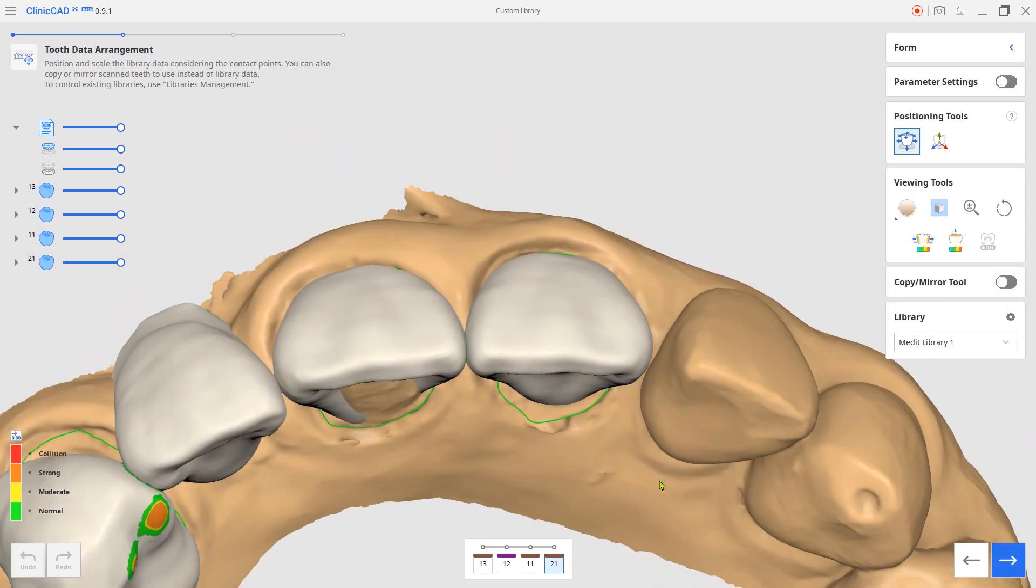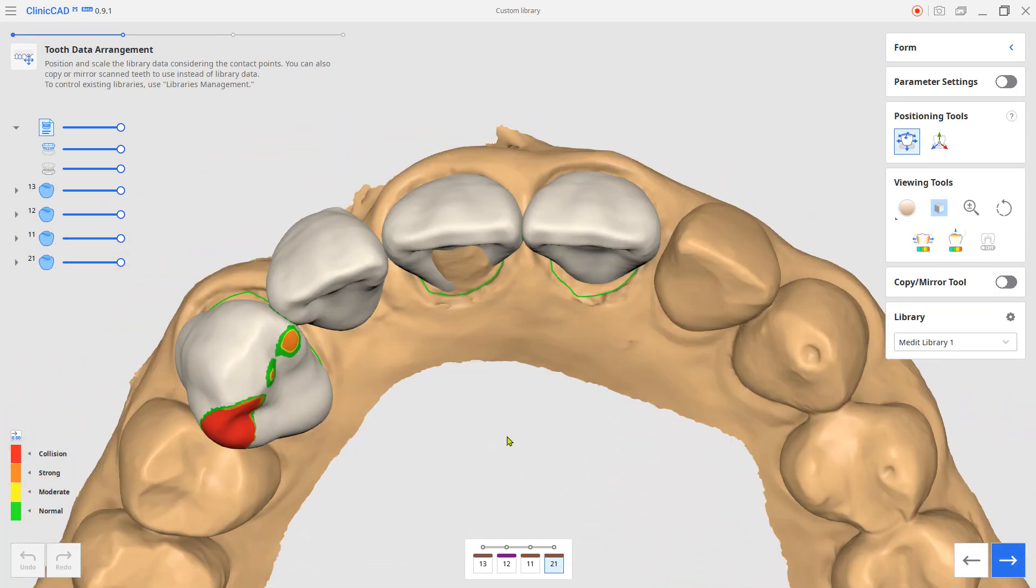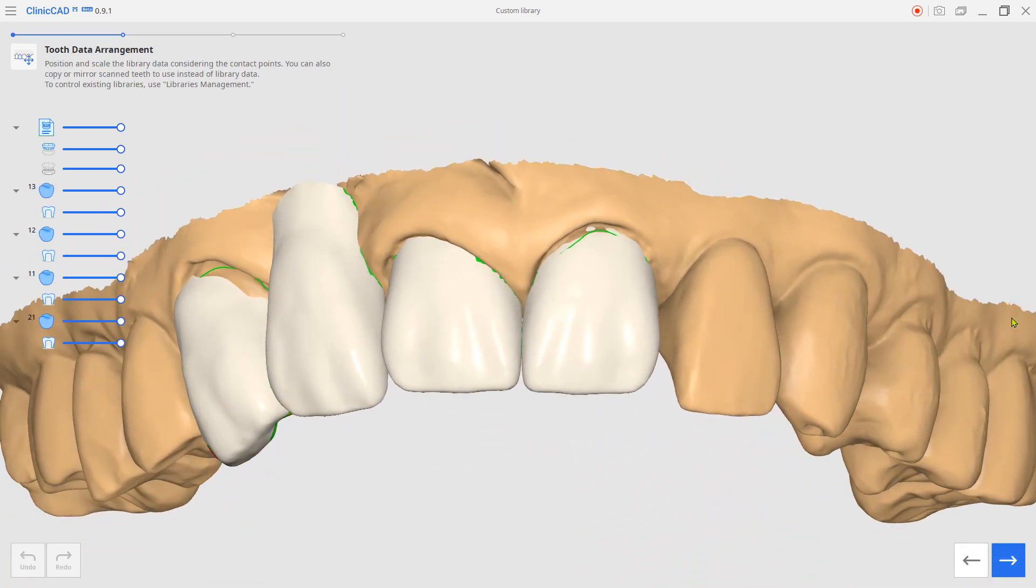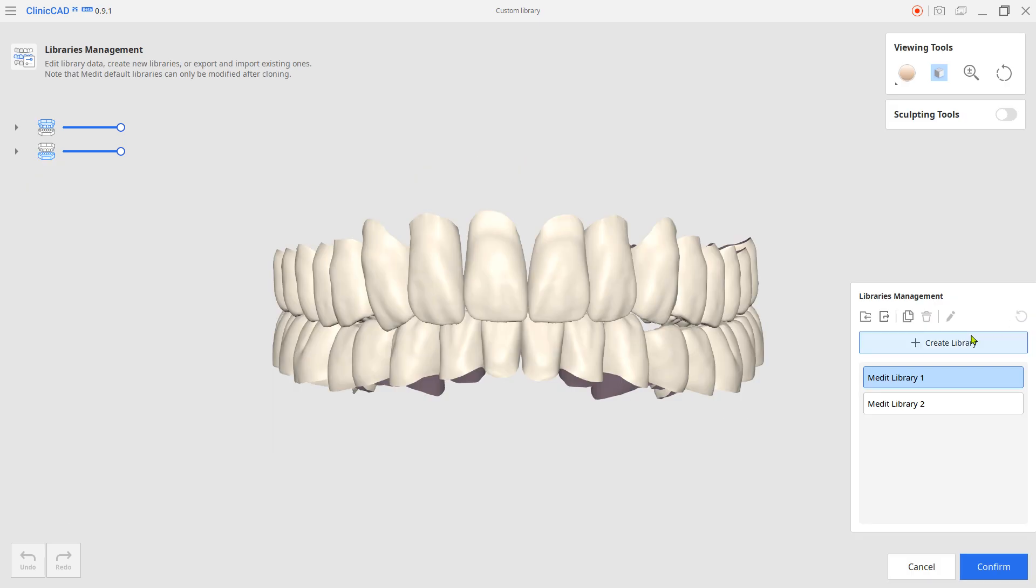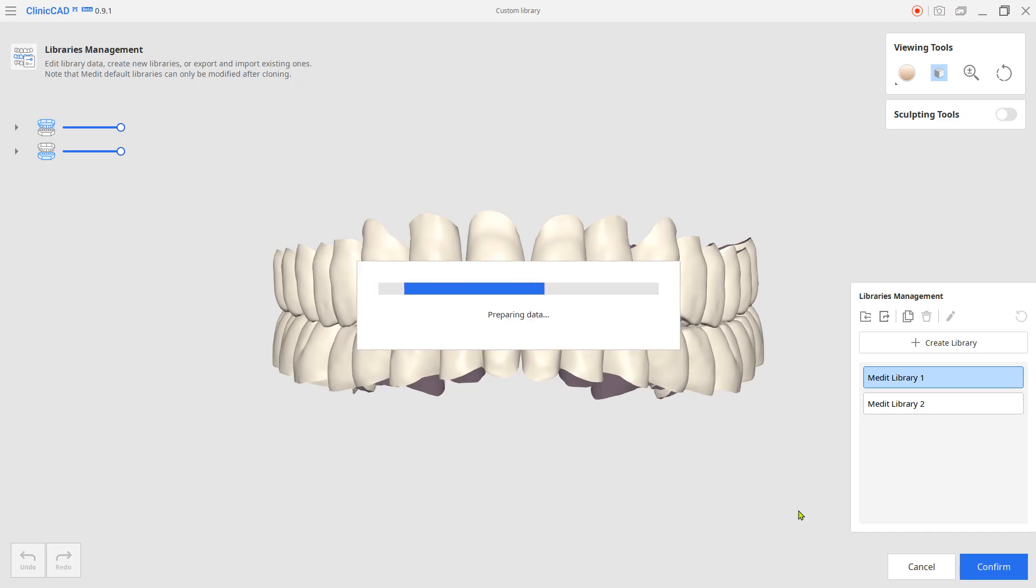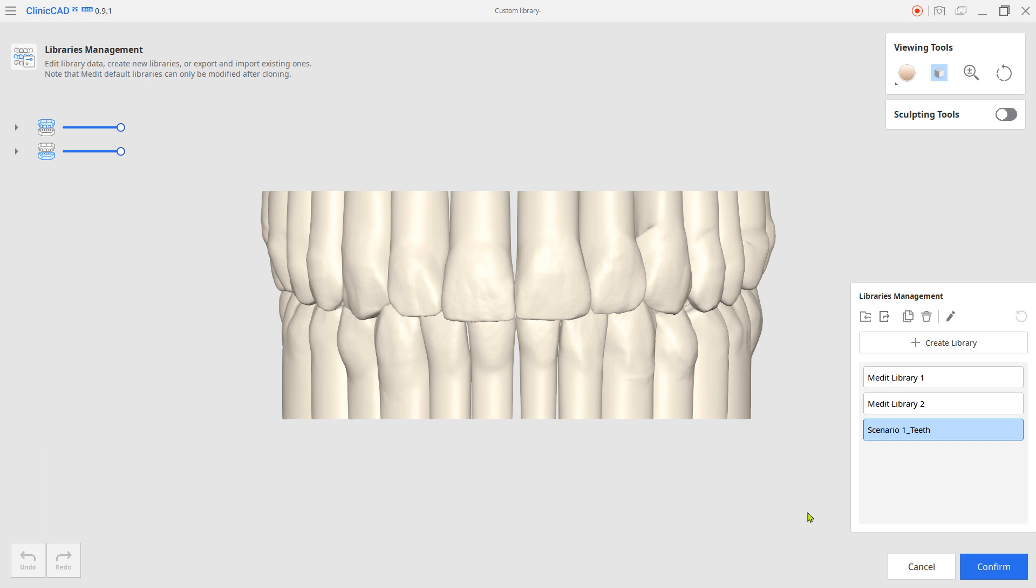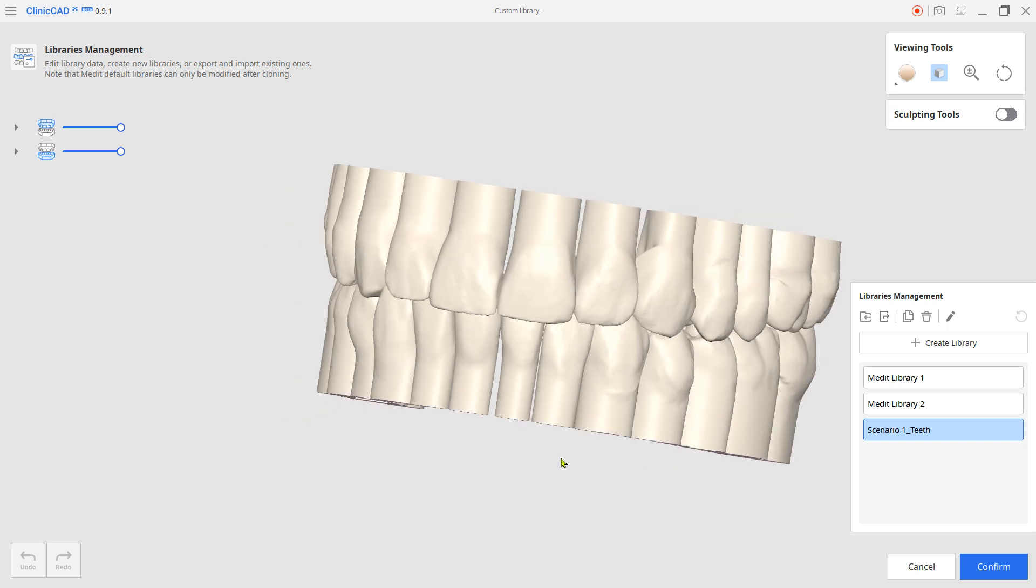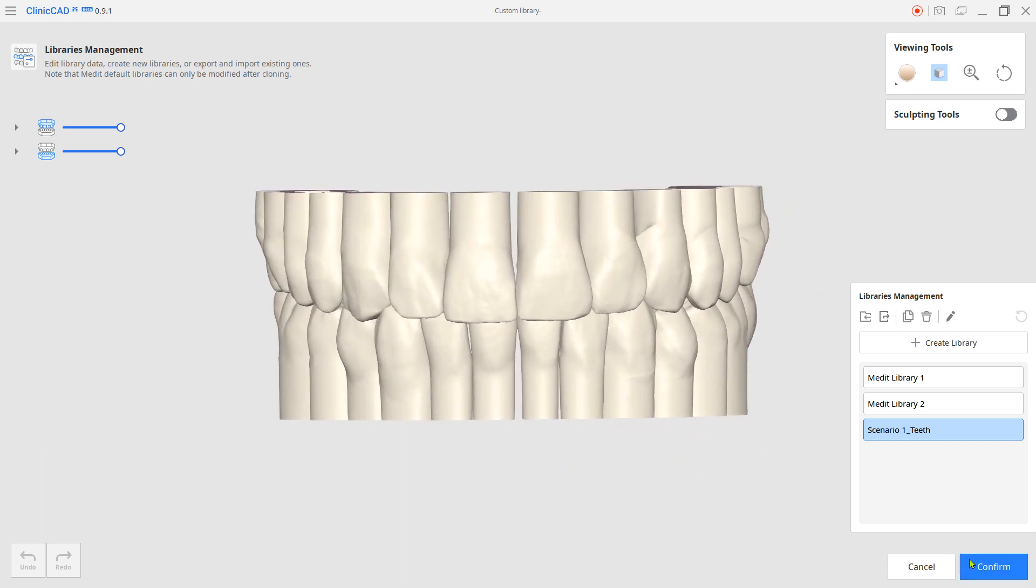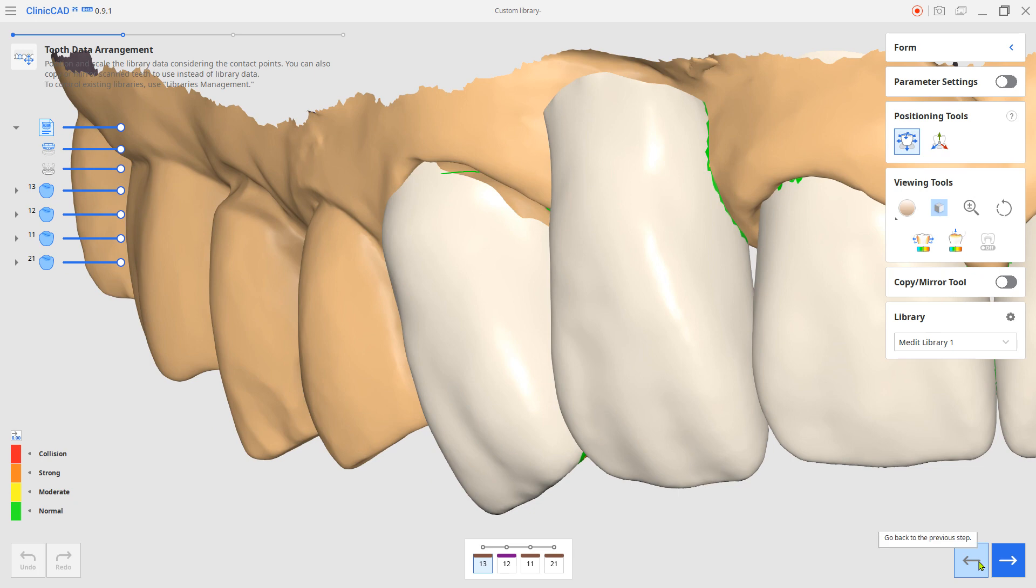Click the library's management UI and select Create Library. Choose the scenario teeth from the ortho simulation and click Confirm. Now, in the library list, you can find one that you just added.